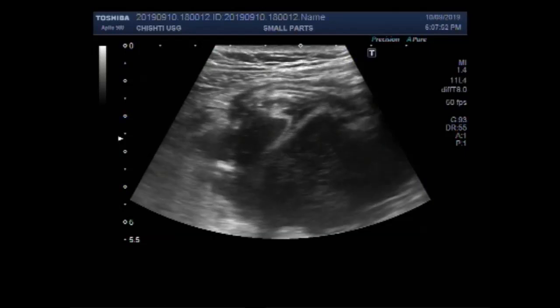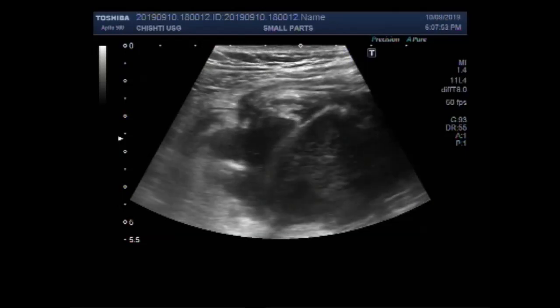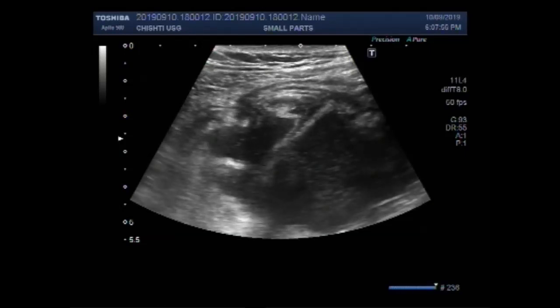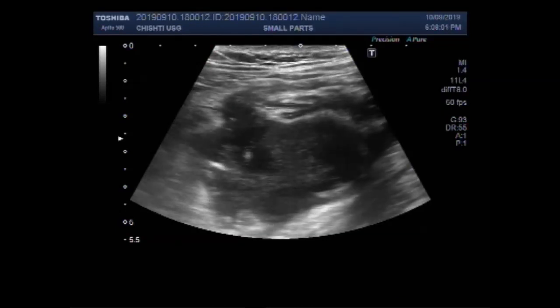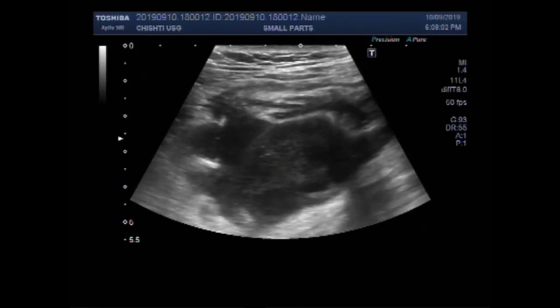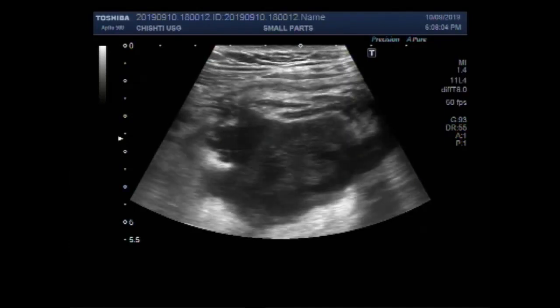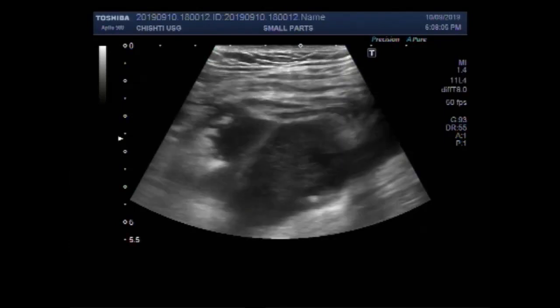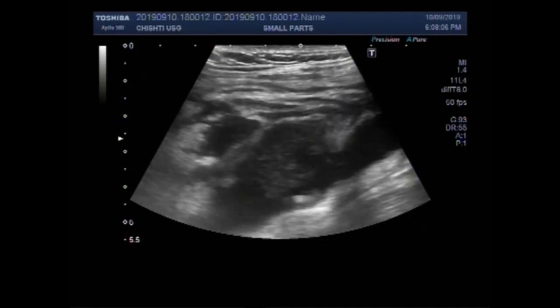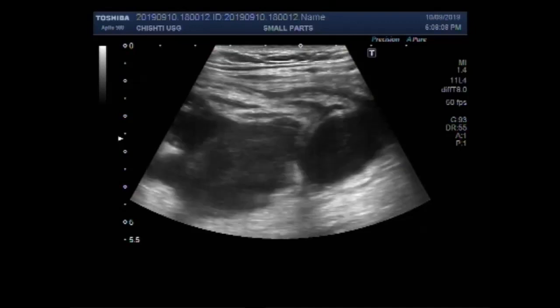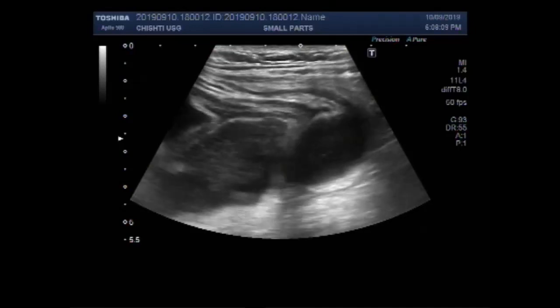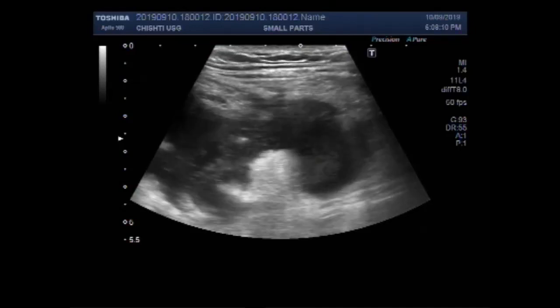Now, again you can see this communication — and this one is the communicating point. Here you can see a significant amount of thick fluid in the adjacent area.